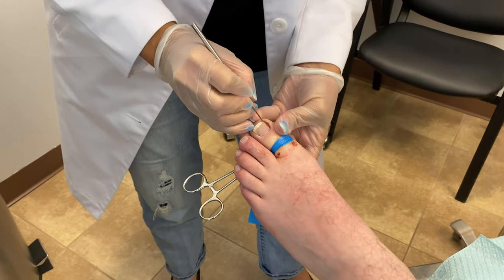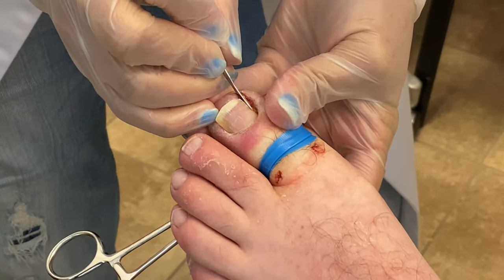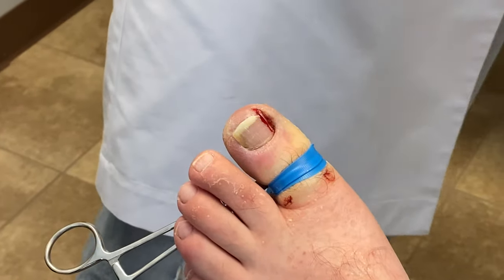You can see here I'm simply taking my blade and going down the side of the nail. This splits the nail border so we're able to remove that portion that's ingrown.